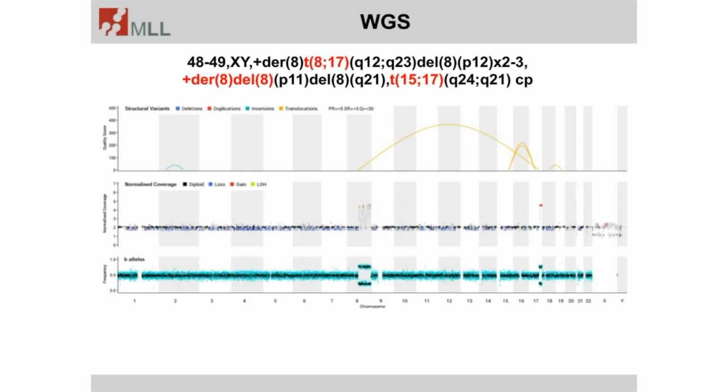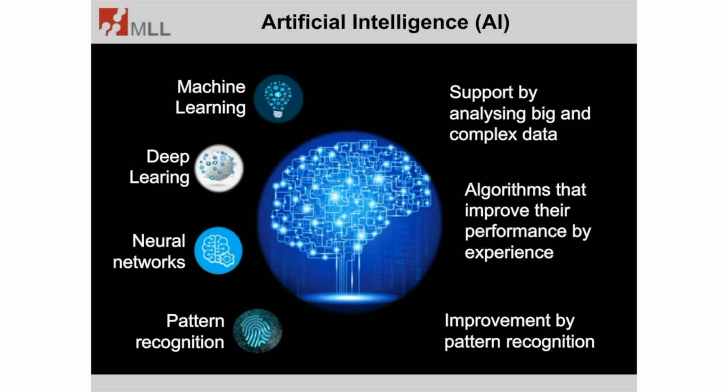This will not be enough to go case by case into the data. And therefore, the only way to analyze this vast amount of data generated by whole genome sequencing is to apply methods for which an increasing amount of data is not a curse, but a blessing. And the majority of these methods belong to the field of so-called artificial intelligence.